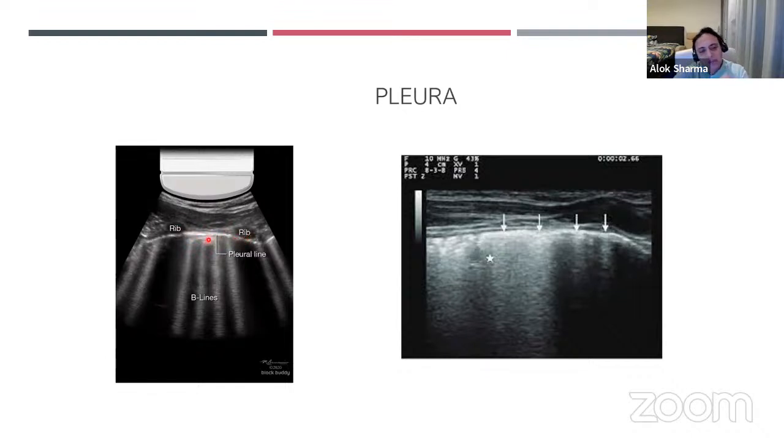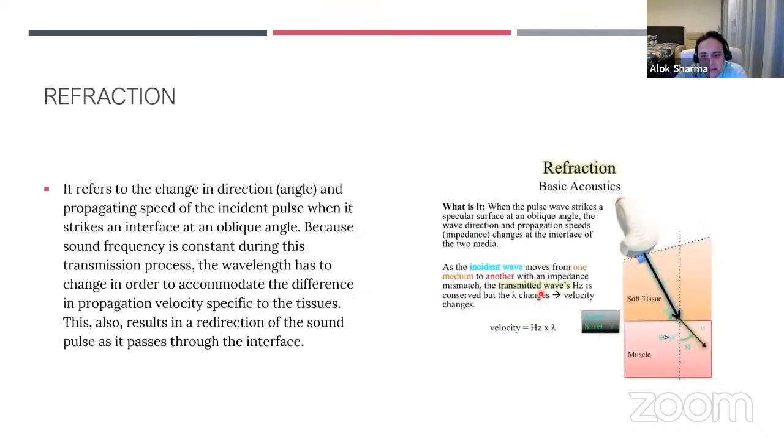But more importantly, as you go into the lung, you can see the B lines appear less bright because sound waves are gradually becoming attenuated. If you look at A lines, they sometimes go back down. If you have what is classically a B profile, again you can see superficial structures, with the pleural line being brighter. But as you go in, the density of the image keeps going down. And that's all a reflection of the properties that we've just discussed.